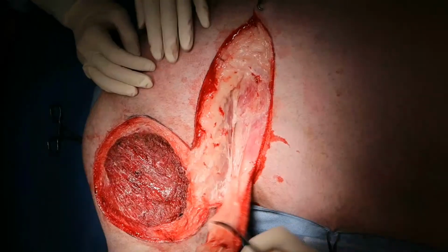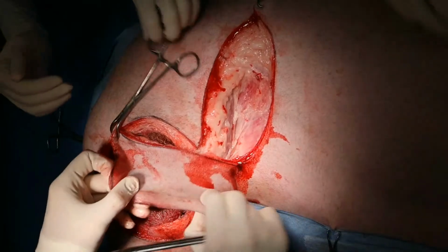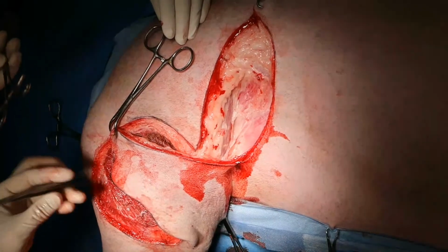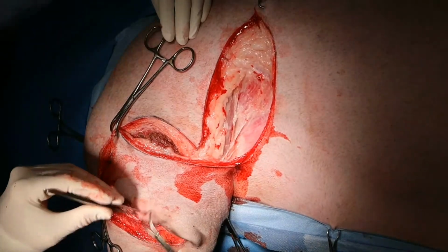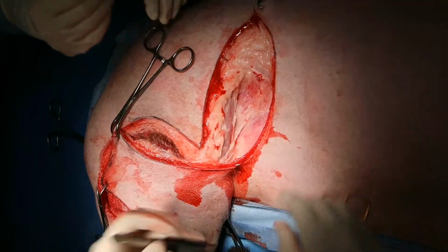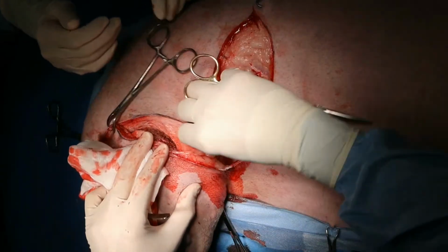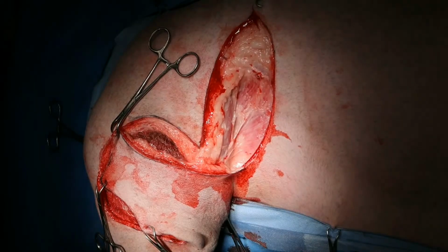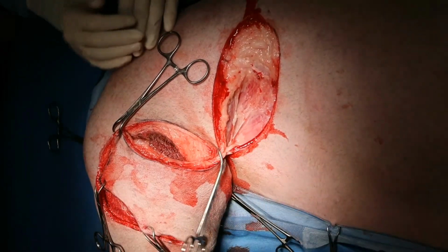All right. So now what we have to do is this guy. I'm going to lay this down where I think I want it to go. Then I'm going to take some towel clamps and just kind of try to space it out generally how I think it's going to go. Like that. And I might extend it just a little bit more so I'm not under tension. And then do we have another towel clamp? Or is that it? Do you want this one? Yes, thank you. All right, so then we'll bring that up here. All right, so that's how it's all going to go together.